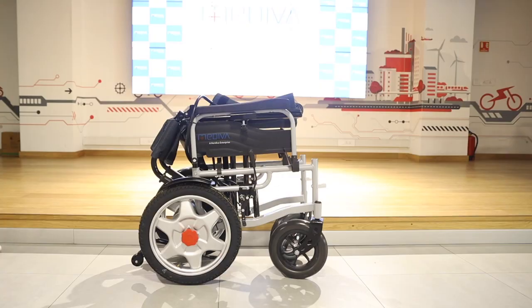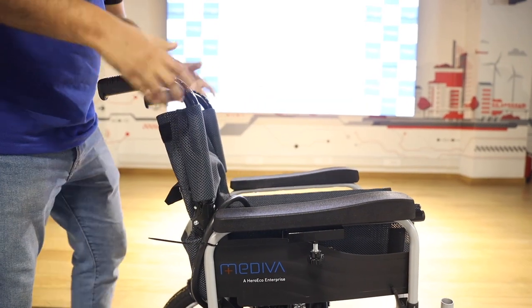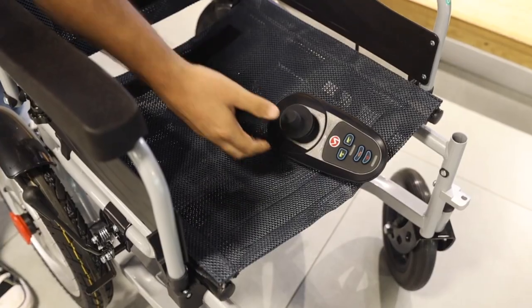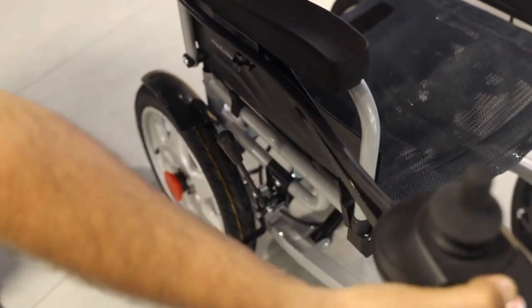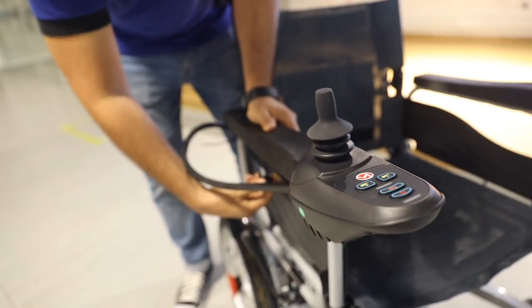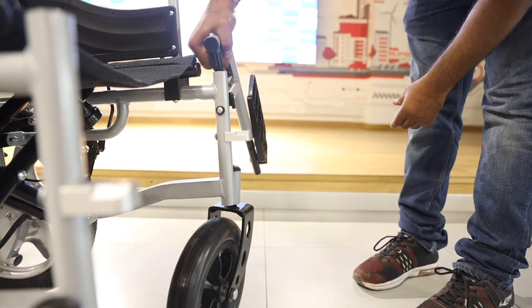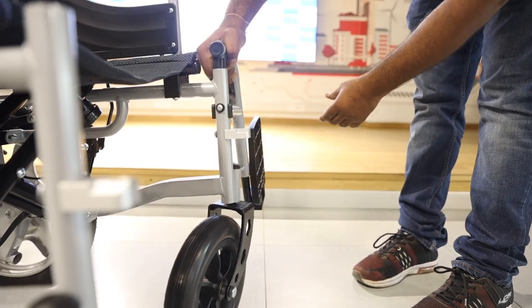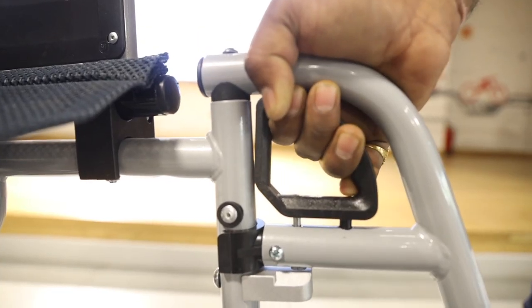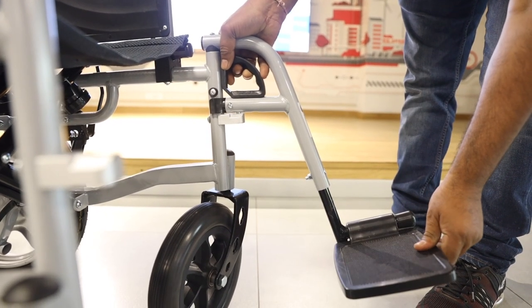To get your Medieval electric wheelchair started, unfold it first. Connect the joystick. Fix the footrest. Now plug in the battery.